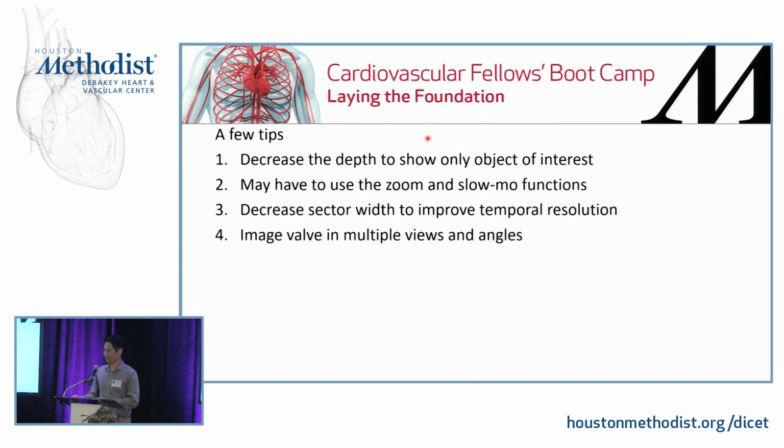So decrease your depth to show only the object of interest. Why do you do that? You do that in order to improve your axial resolution, right? So you can tell that objects in front of each other are 2 different ones instead of the same thing.